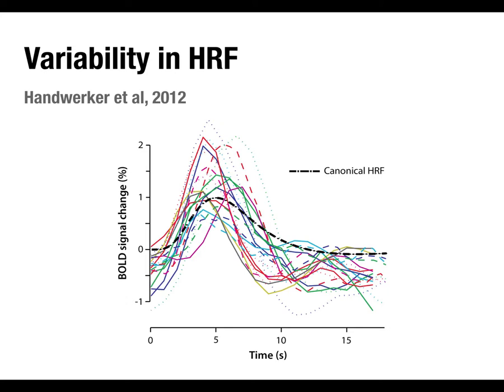So you can imagine, yes, it's slow, but we could potentially interpret this purple one, which is a bit later, compared to, say, the yellow one there that's earlier. You could say, if there's a one-to-one relationship in timing between neural activation and the peak of the BOLD response, even though it's delayed, we might be able to interpret that. Say this was all within one subject, and purple is one brain area, yellow is another. You could be tempted to say, oh, the purple area activated later because its BOLD response is later.